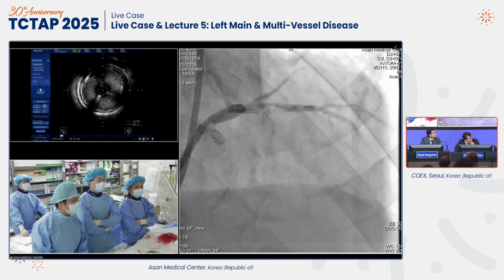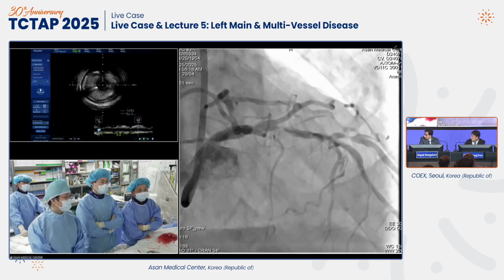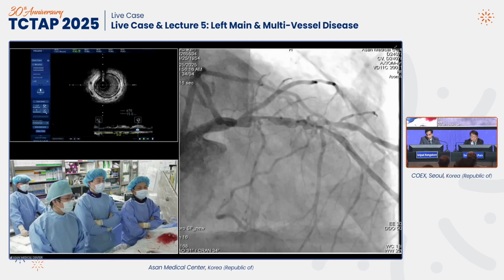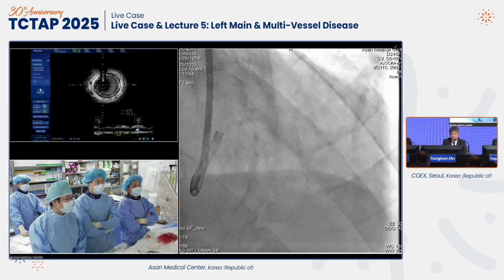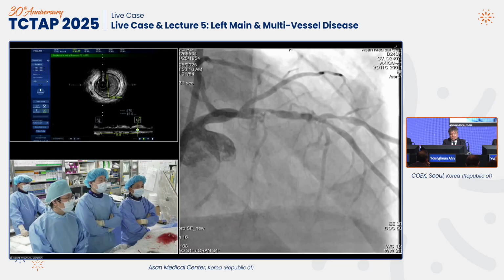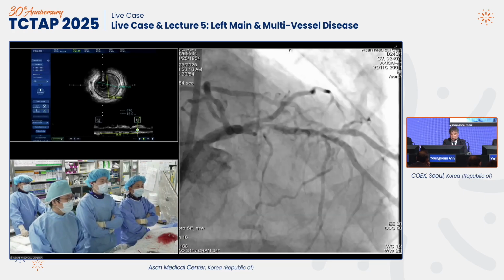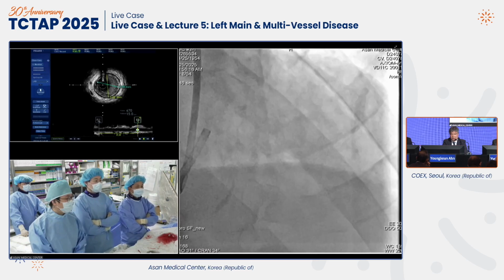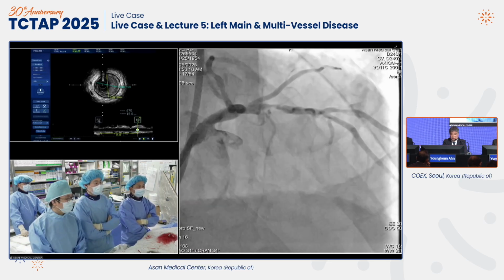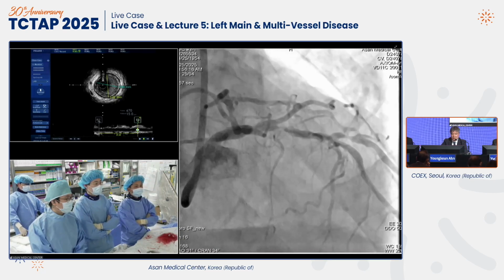Any other suggestion? Do-Yoon, I am Youngkeun. When I see the left main to LAD regions, I think there is a calcified region with very tight stenosis. The LAD is a very important feeding artery for making collateral flow to the distal region. So what do you think about how we can cover the LAD stenting?